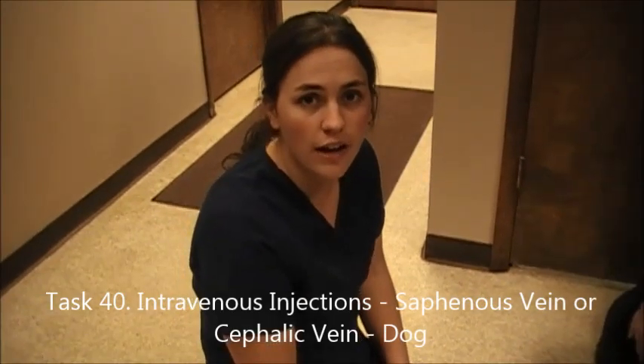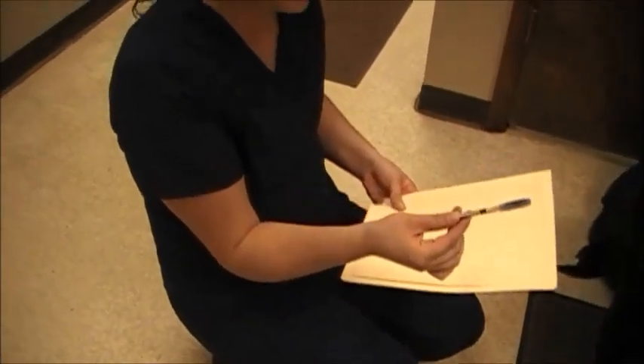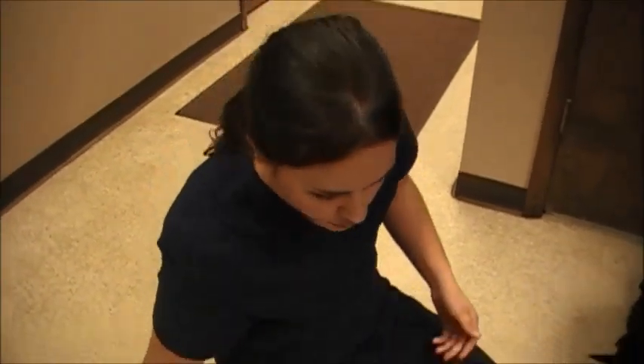I'm doing an IV injection in a dog right now, in the cephalic vein on the front leg. I've verified on the record that we've got the right patient, the right medication, at the right dosage, and the right route of administration. So we're doing 0.2 mils, going IV directly into the vein.